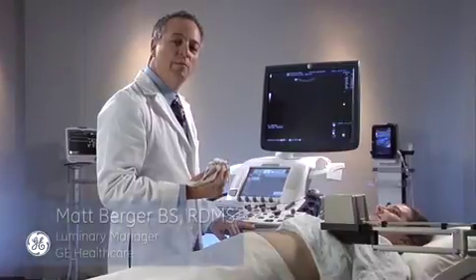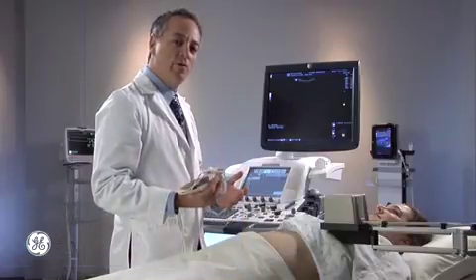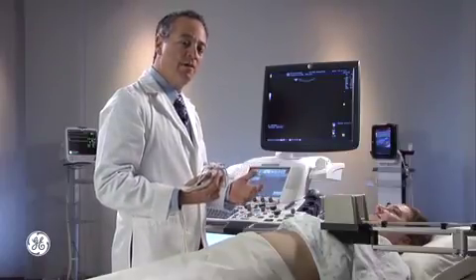Volume navigation gives me the ability to scan live with a previously acquired ultrasound volume. Maybe there's a specific area of interest that I'm trying to track over time, and I want to see within ultrasound, has anything changed? I'll walk you through the steps on how to do that.